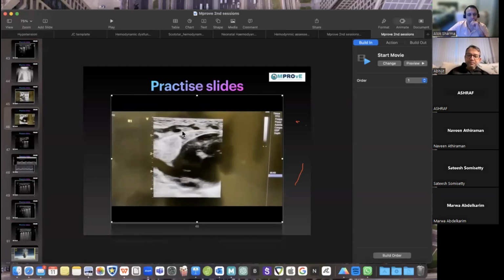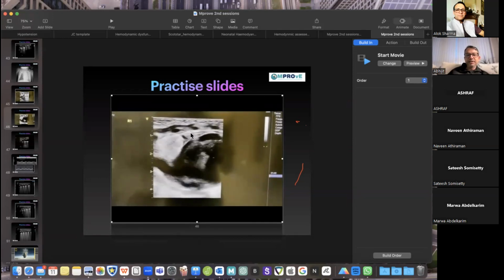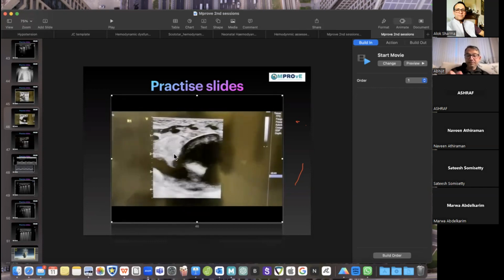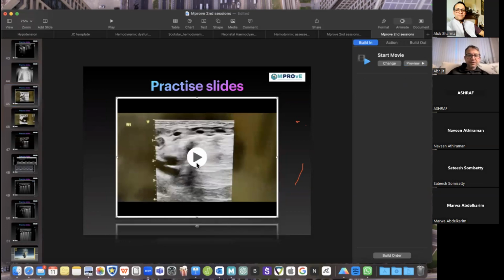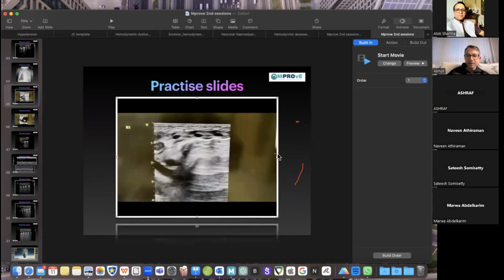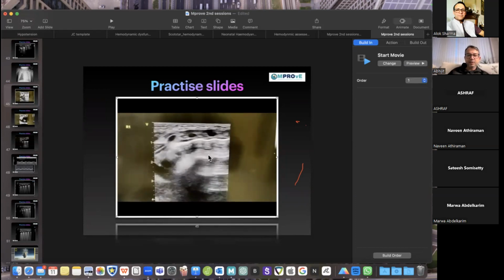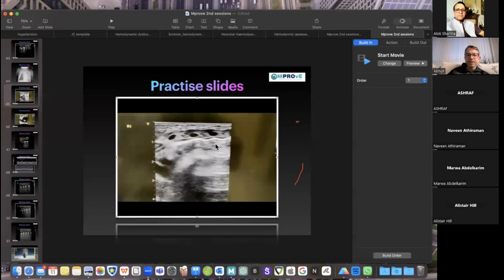Am I going to see any sign of a nice discrete pleural line with this thymus? Because remember, this is the first image, just perpendicular on top of it. I see a normal lung. I do not see any broken or disrupted or gross or diffuse pleural line.